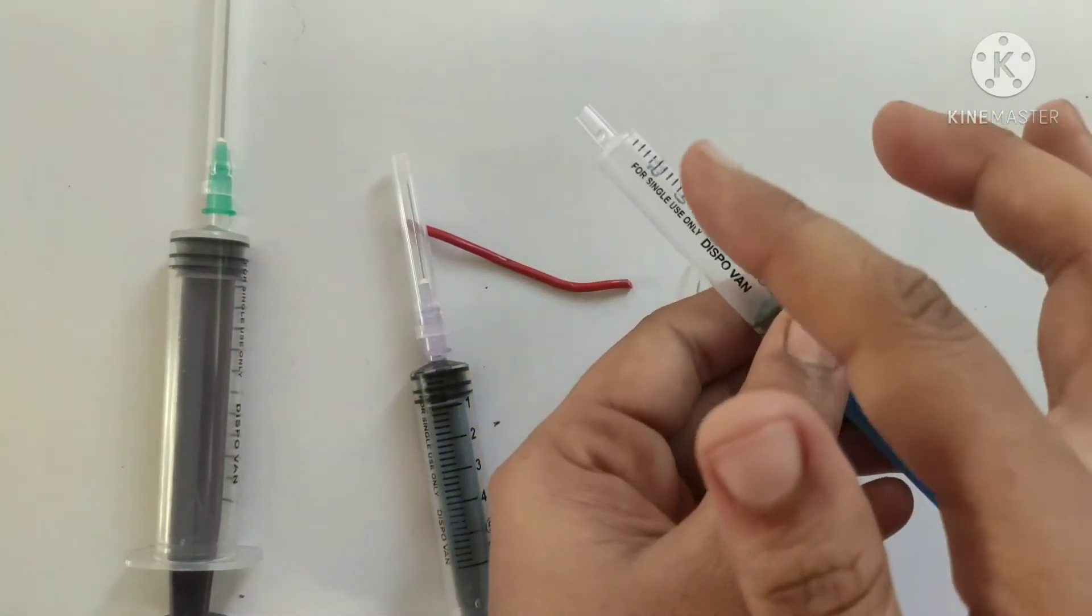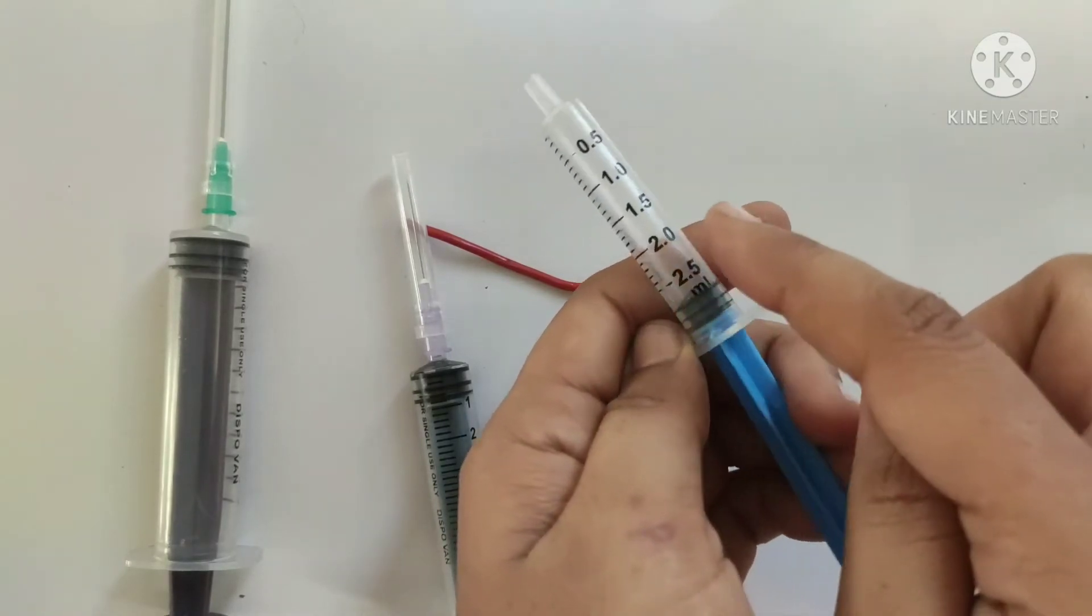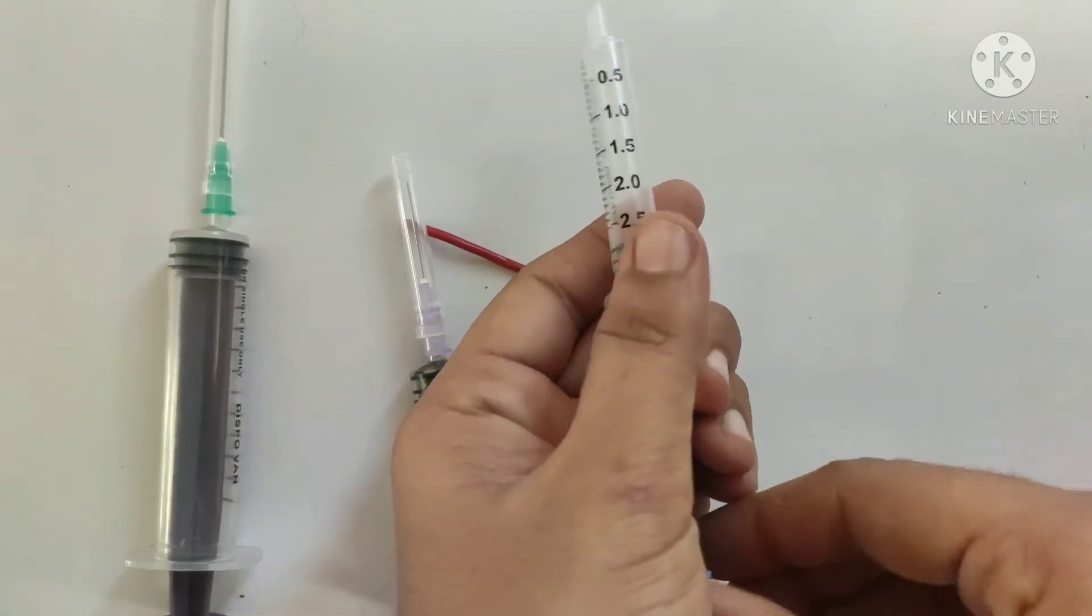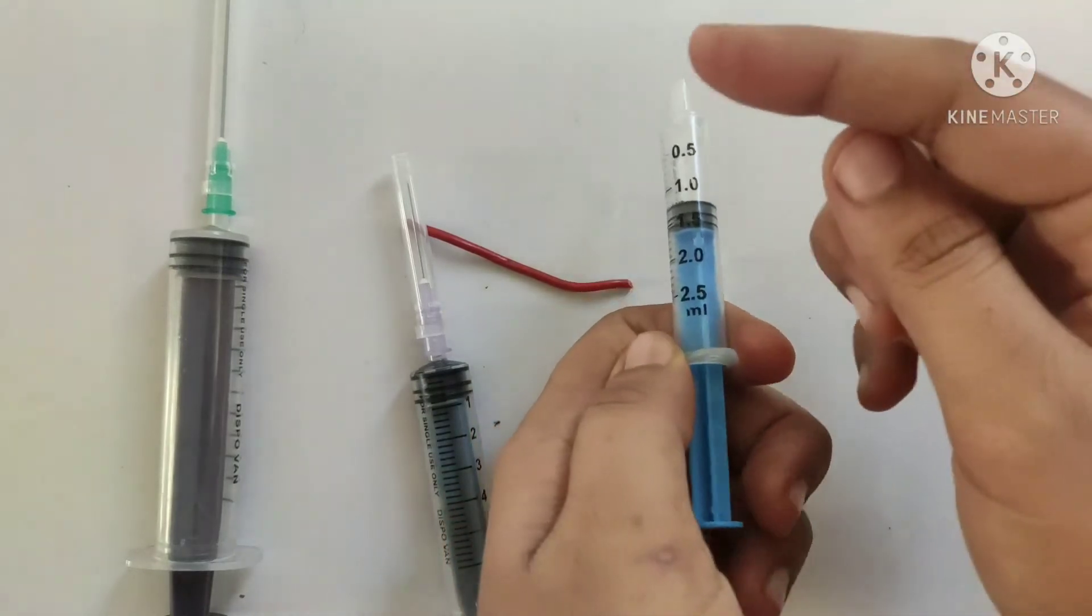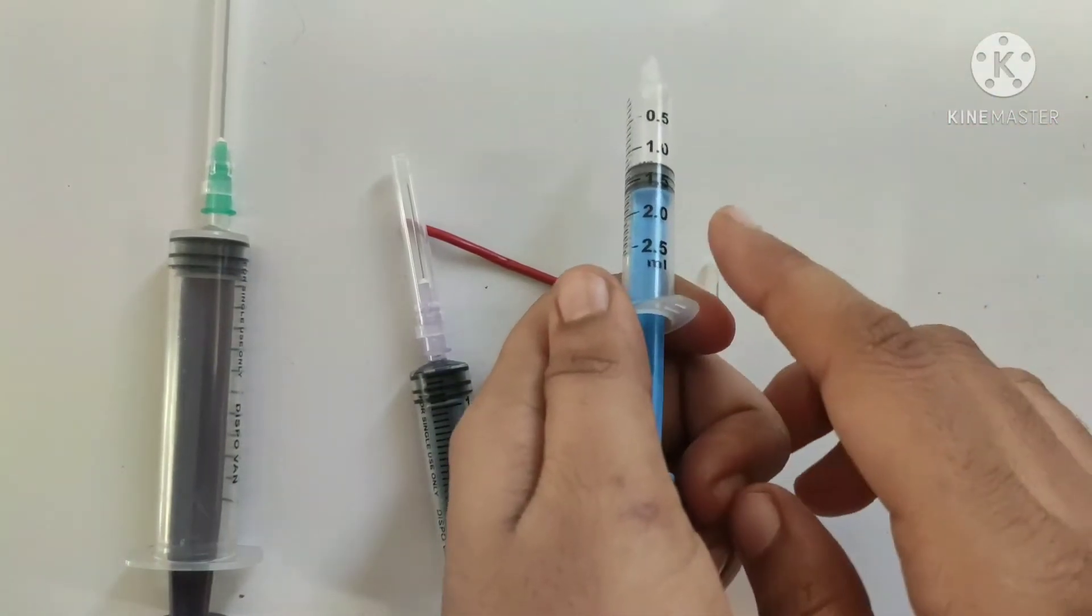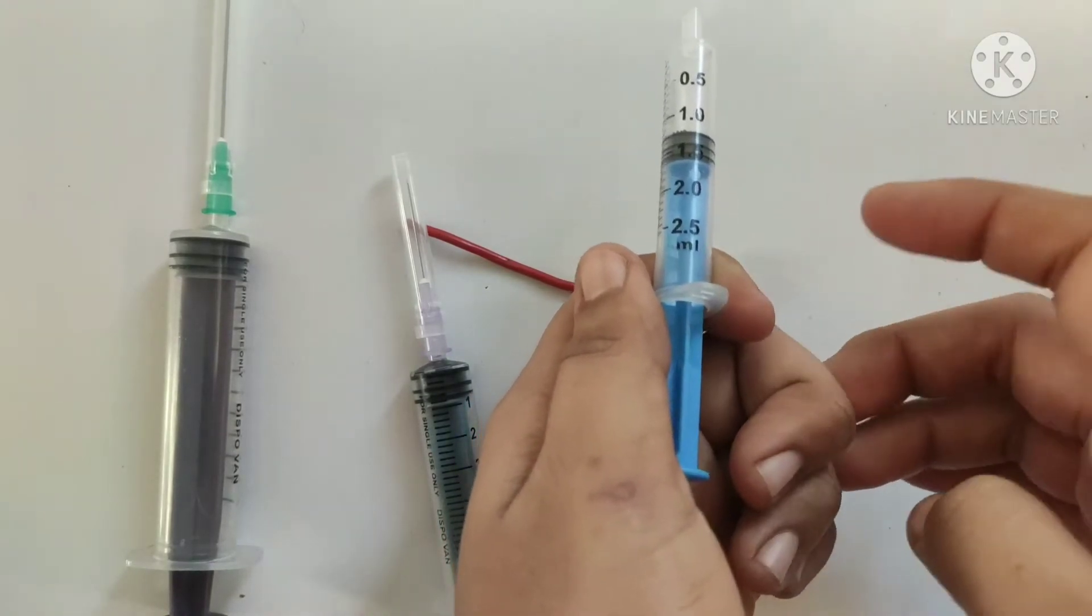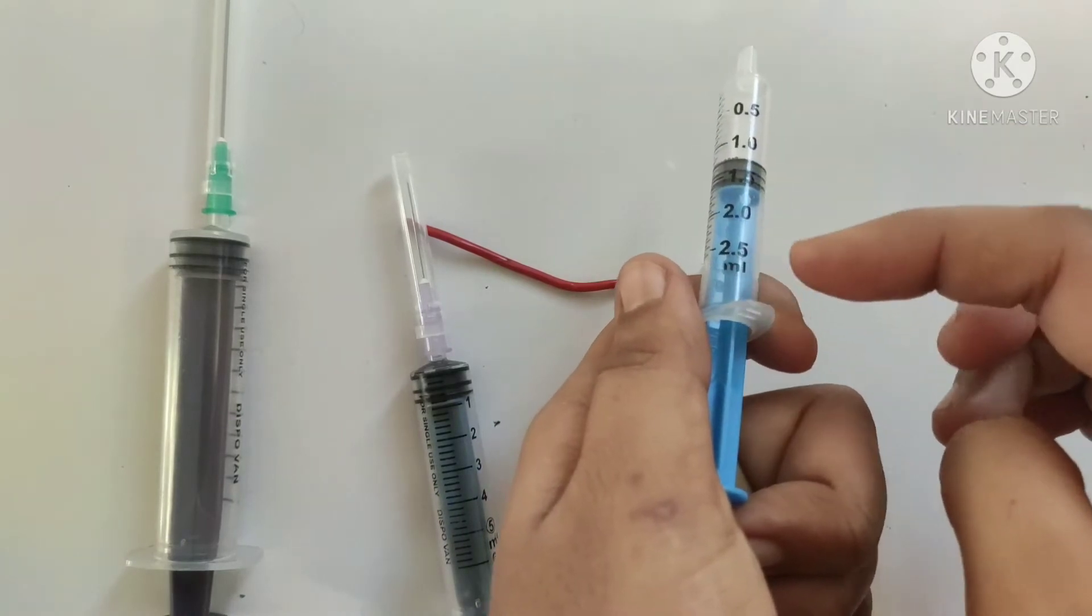Now the fluid is entered in this part which is known as barrel. This barrel has indications: 0.5, 1 point, and so on, which are in ml. But when the syringes are insulin syringes, these indications will be in units and not ml.